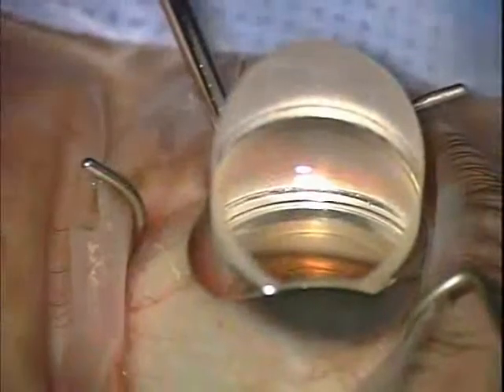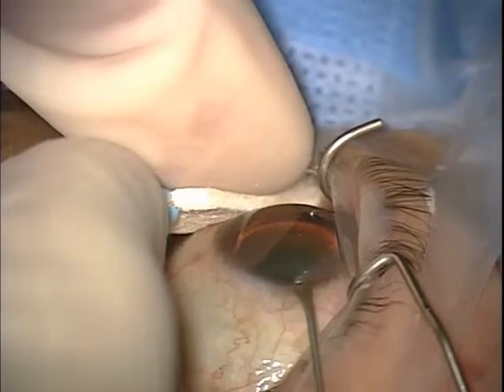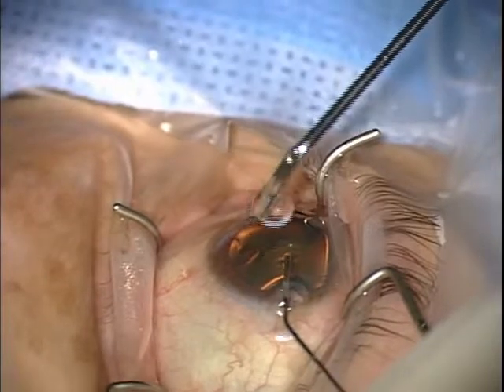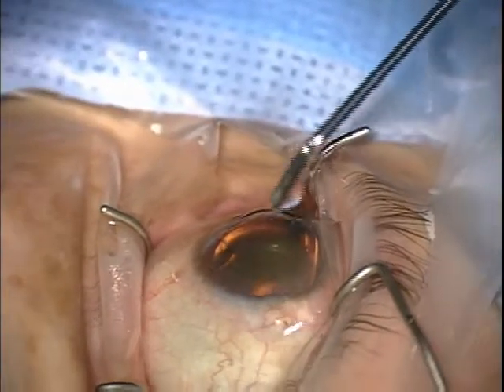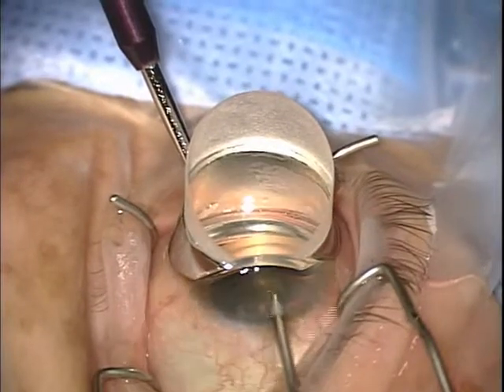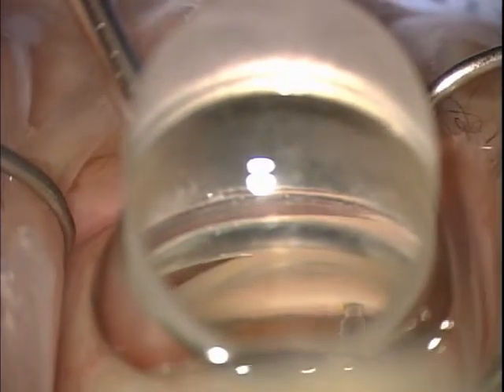The Trabectome procedure is shown here. Initially there is a corneal incision. Viscoelastic or a lidocaine or other anesthetic is injected intracamerally. The gonio lens is placed on the eye and the tip is advanced across the anterior chamber, and the initial trabecular meshwork removal is initiated.